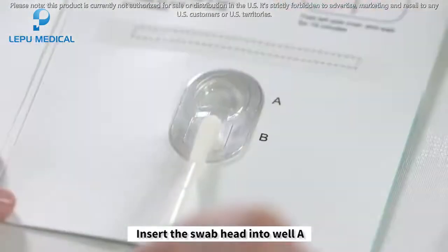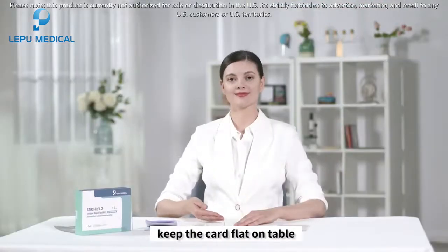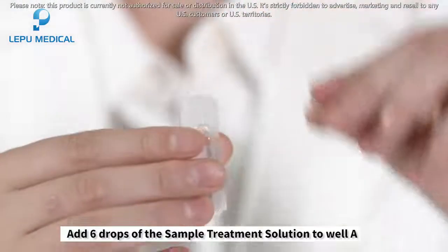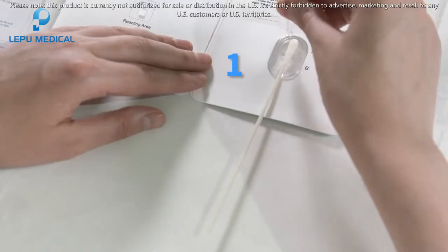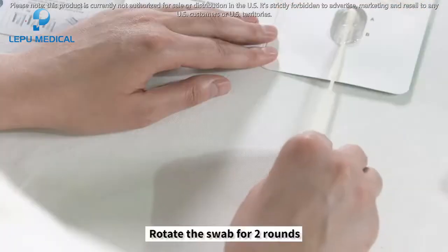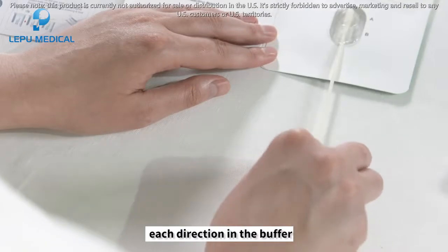Insert the swab into well A from the bottom of well B. Keep the card flat on table. Add 6 drops of the sample treatment solution to well A. Rotate the swab for 2 rounds, each direction in the buffer.